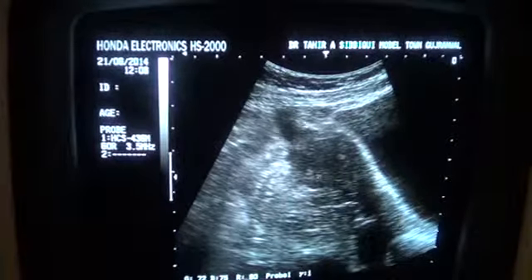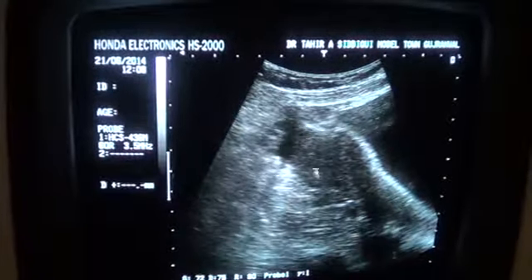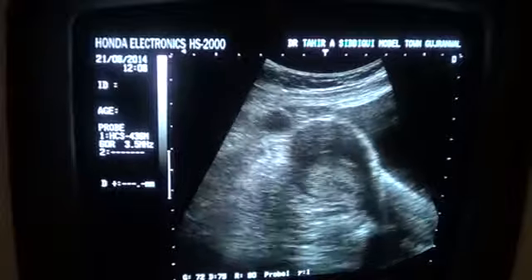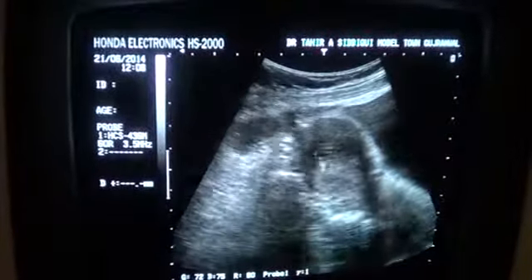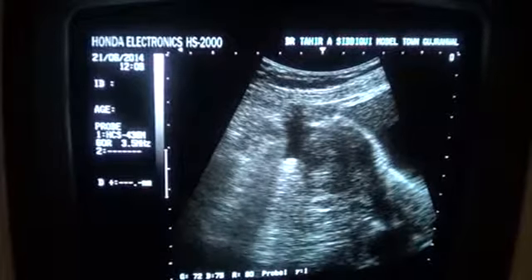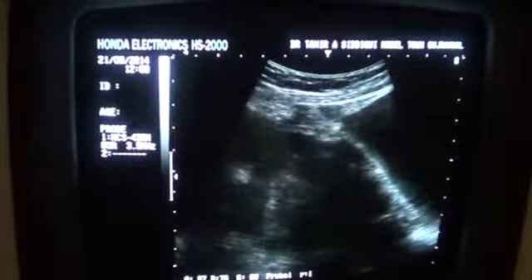Now see this area, concentrate on this area. This is the uterine fundus. This is a very clear endometrial canal in a very early proliferative phase of the menstrual cycle. Now concentrate on this region and you will see bubbles floating in this small amount of fluid.